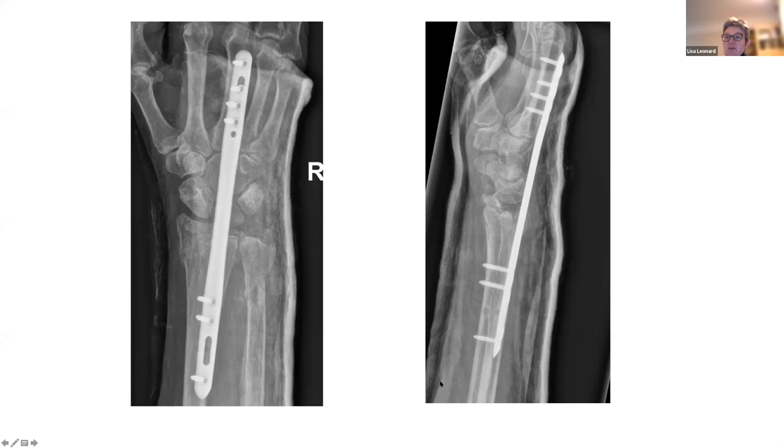I think Sumedh pretty much covered it. The carpus wasn't aligned with the radius, and it is unreconstructable. I don't think you're going to get any screws in any of that. So this is the best option, I think. It's out to length, and you haven't had to do anything to the ulna. I don't know what you do, Sumedh, but we usually take these out after about 3 months, just to see if they can get a jot of movement afterwards. But at least if you need to do something like a fusion or a wrist replacement, possibly you would have something that was lined up vaguely. So I think she did quite well.